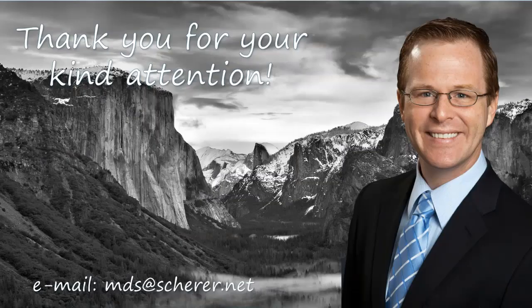So that's been a background as well as a really good fundamental concept of what we're doing here, thinking about our patients both from a rudimentary beginner point of view, which would be just to start out with our 2 implant overdentures, 22, 27 position, and also thinking about future treatment needs, whether it's maybe I want to leverage some of the 3D scanning, 3D technology, cone beam, computerized surgical guide, etc., and put 4 implants in today.